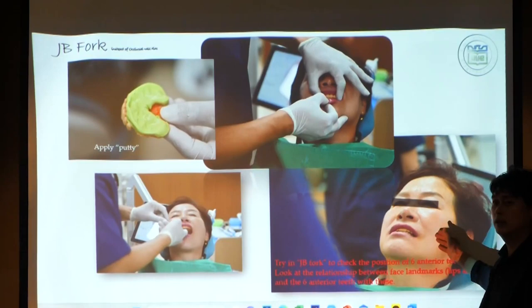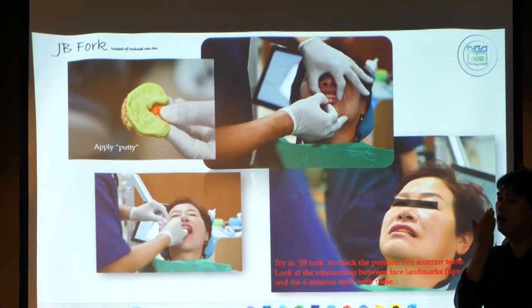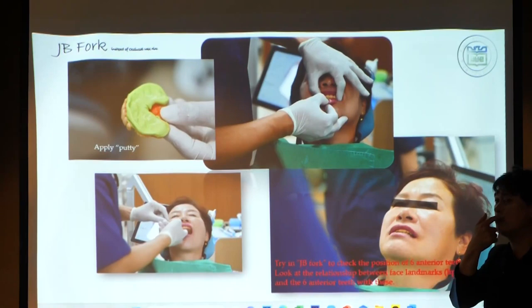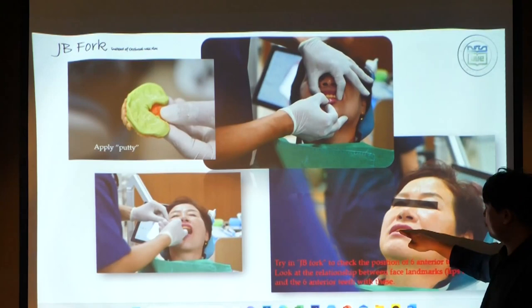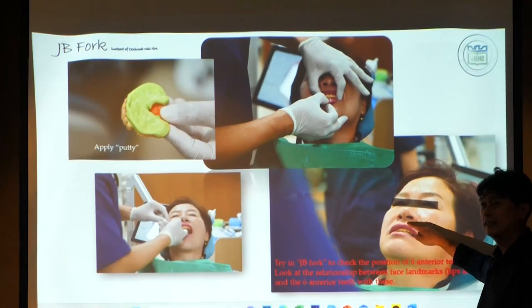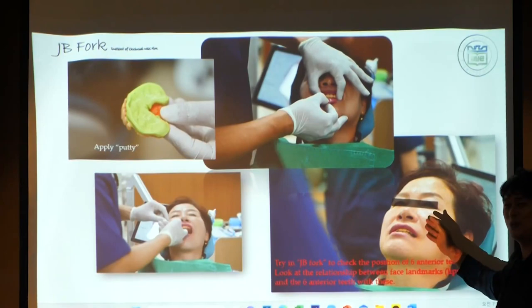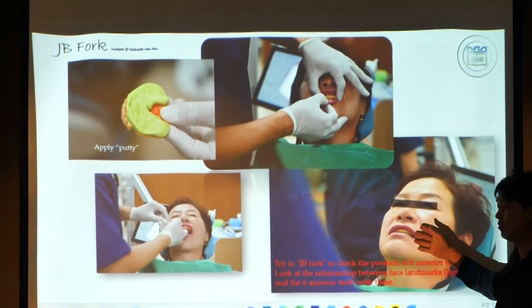Madam, is it the right position? Are you okay? Are you satisfied? At that time the patient may say she wants the inside of the oral cavity done, or she wants more lip support, and I can discuss it together. And then I position these six anterior teeth appearing about 1 to 2 millimeters from the lower border of the upper lip. Then I discuss, and she confirms the position, and after that every procedure is her duty, because she decided already. I'm following her choice, you know.